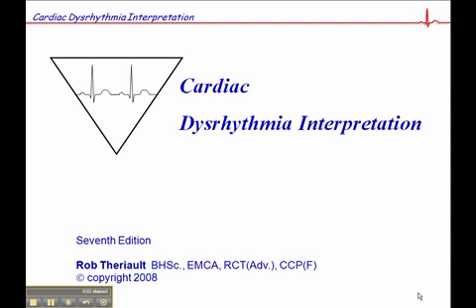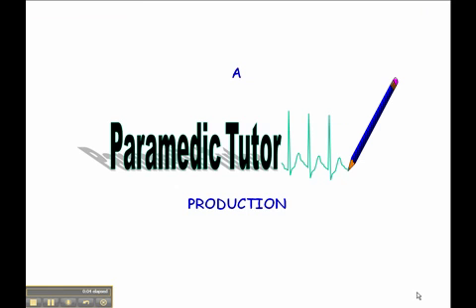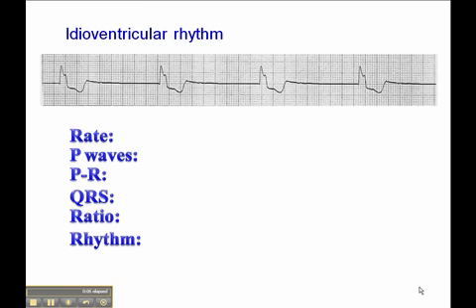On page 71 of your Cardiac Dysrhythmia interpretation book, you'll find an idioventricular rhythm. This is a rhythm where the focus originates from the ventricles. In other words, the focus that depolarizes the myocardium originates from the ventricles.